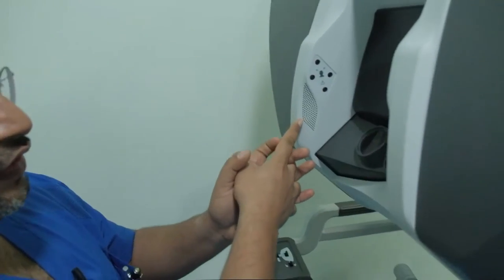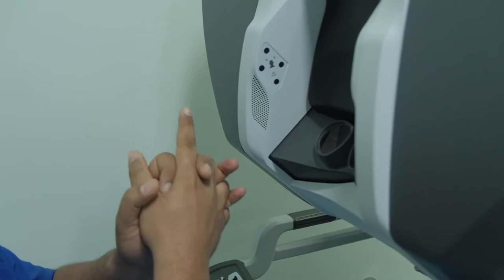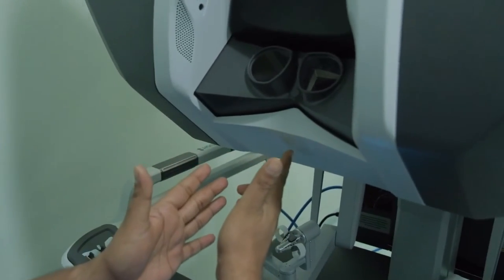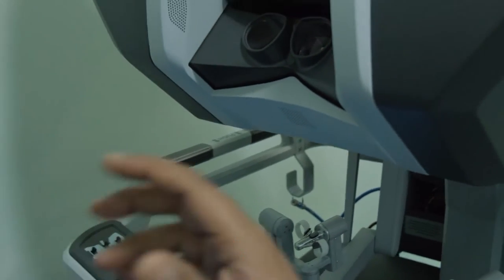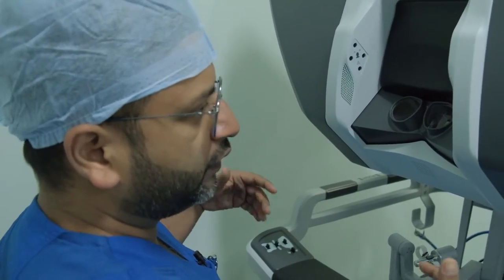Also, there is a speaker inbuilt in the shell. So this speaker takes away all the sound, whatever the surgeon is saying, to the patient cart. And there is a microphone also. So whatever the surgeon is saying is taken to the patient cart, and whatever the assistant is saying is taken to the surgeon console, so that there is no gap in communication and the surgeon and the team in the OR can effectively communicate with each other.